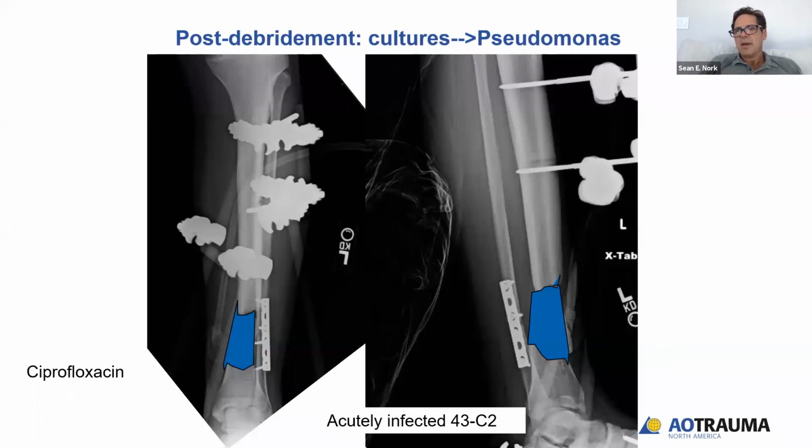Just transport. Because I'm the occasional transport guy, and I just can't imagine a docking site miss and all of those issues. So I try to get an intramedullary nail in so that I can transport over the nail, because I never miss with my docking site if I'm transporting over a nail.